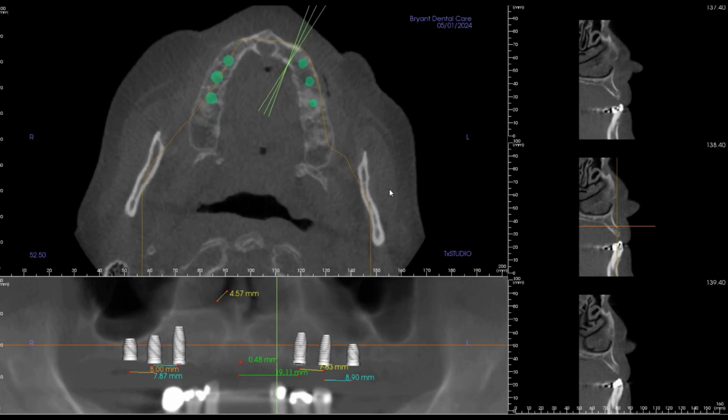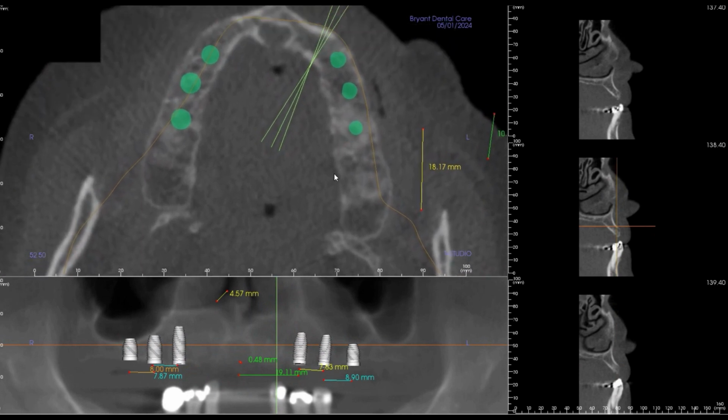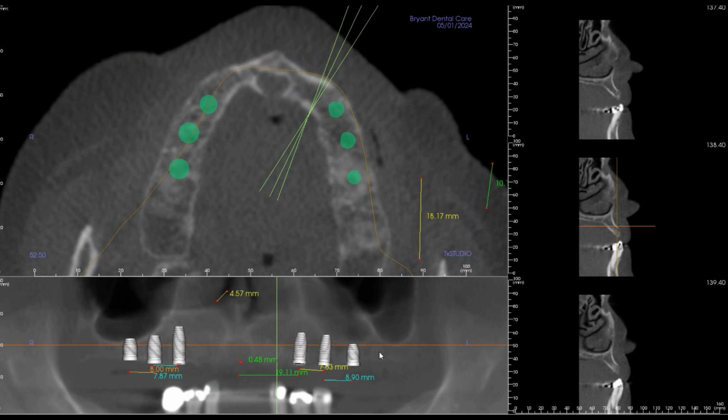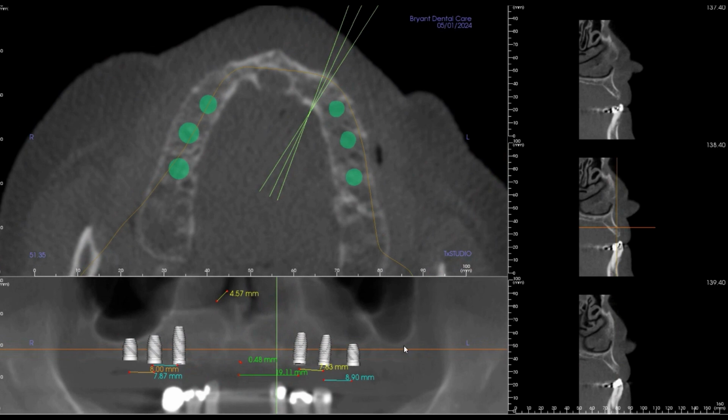As far as the potential bone spicules that are left over, let me just pan up and down. So on that left side, you can see here and here. Fortunately, they're right in the zone of where we want to place the implants, but they'll be easy enough to pop out. Just lay the flap and get them out pretty straightforwardly. Right side looks pretty good. Take that back right around number 6. Looks like there's something going on there.